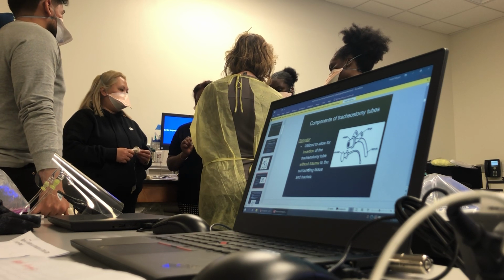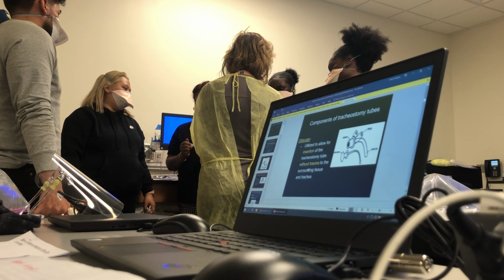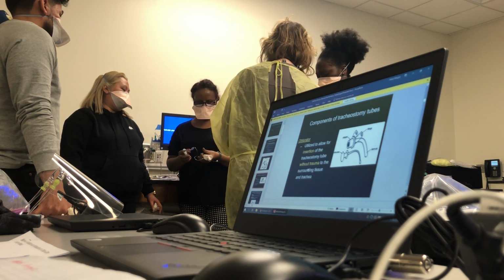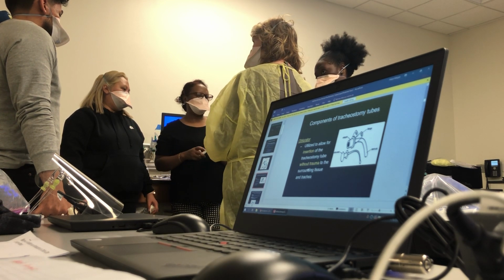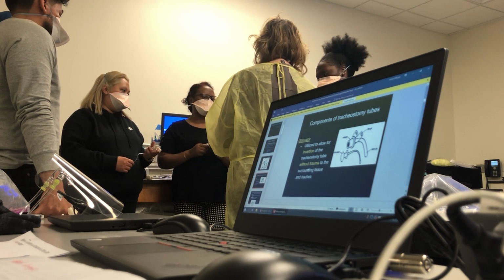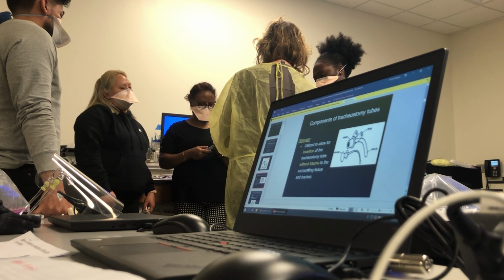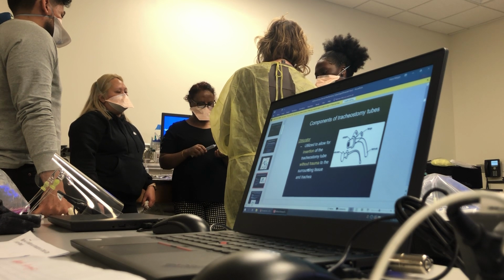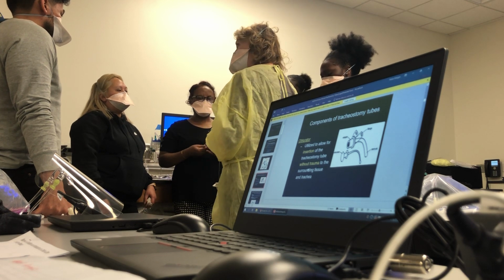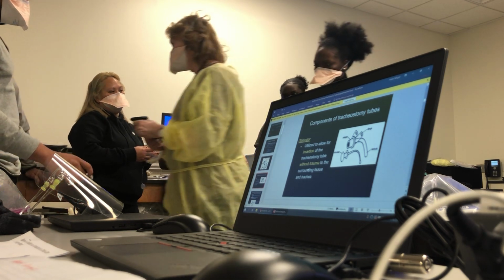Okay, now I'm gonna take air out because it's too tight. Feel that? Okay, how much less air? Okay, so this is gonna be tight. Feel that balloon. If you go into somebody's room, feel this balloon. You know that pressure is high. Okay, you just know it, just by touching it. Okay, 120. 100. Down. Okay, there you go. All right, so hopefully you understand a cuffulator a little more. Make sense? Yeah. Okay, all right, let me put this back.